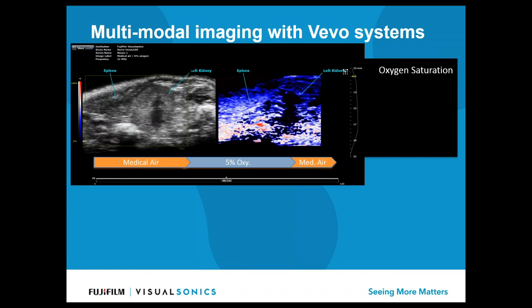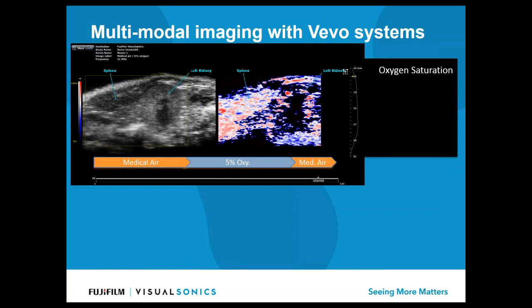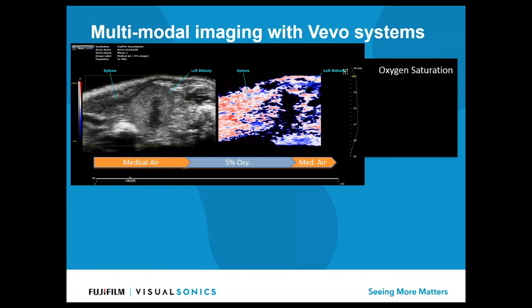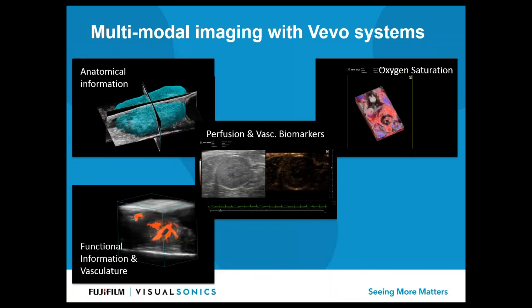And as in oxygen saturation measurements or in photoacoustics in general, it's not required to add any contrast agents. Sorry, somehow my slide jumps here. Oh, I'm very sorry, this slide doesn't work properly. Okay, so you can only see the small picture on the top right here, where you can see that we also can monitor oxygen saturation in the whole abdomen, in the whole body of the mouse here, which is nice to see.